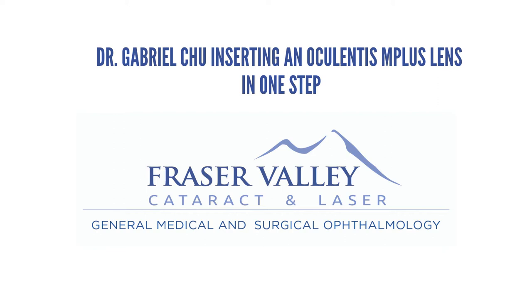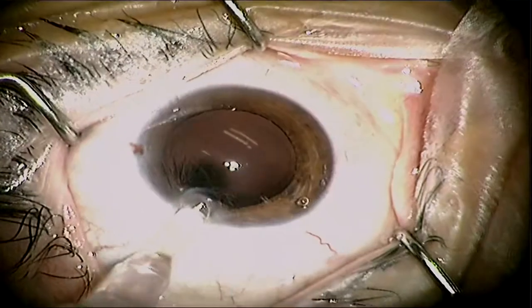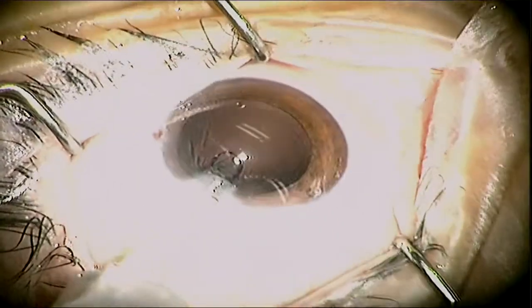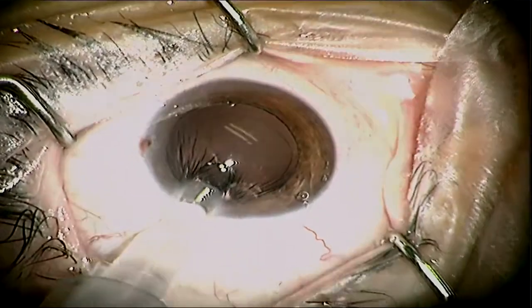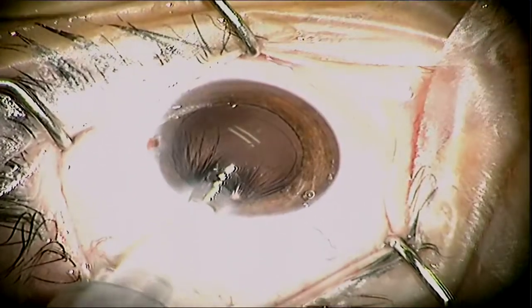This is Dr. Gabriel Chu from FVCL in Surrey, BC. Today with this video I want to talk a little bit about the insertion of the Oculentis M Plus lens and how to safely and efficiently put that lens right into the capsular bag in one step.